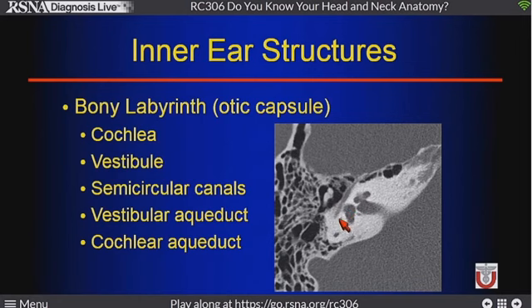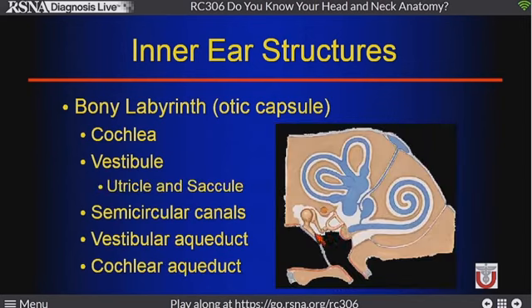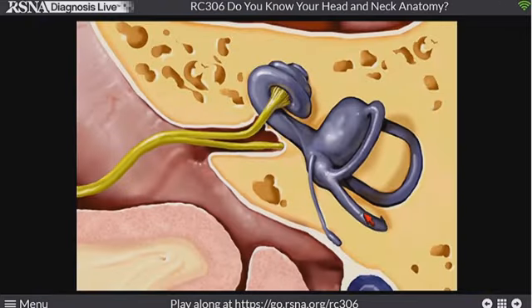If you look closely at pediatric heads, it looks like those inner ear structures are huge and the rest of the head is growing around them. So we have the cochlea, hearing, we have the vestibule and the semicircular canals, our balance, and we have two little aqueducts, the vestibular and cochlear, and we think about these as little channels, potential routes of spread of infection from intracranial disease into these structures. So again, otic capsule, densest bone in the body, and then the membranous labyrinth, the fluid-filled structures that are inside.